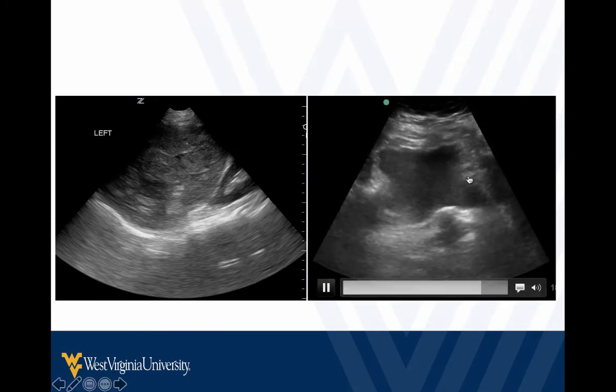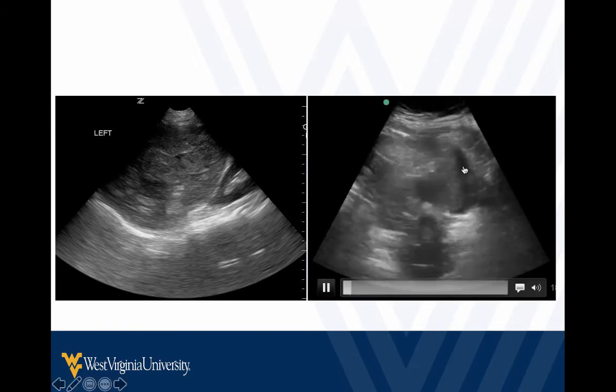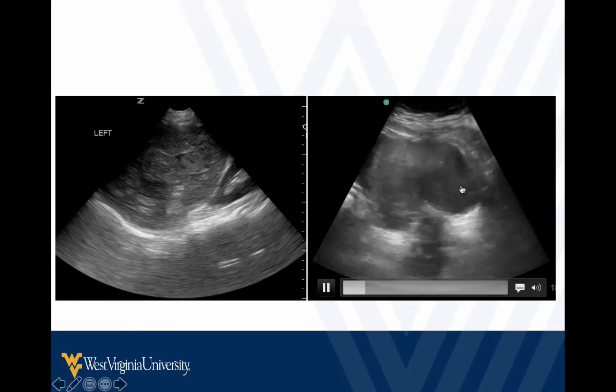And then pointing out over here, this is somewhere around the bladder, like we talked about in the hemopericardium example, blood is not always black. So you can see some of this is black wrapping around, but a lot of this is gray, partially clotted blood.